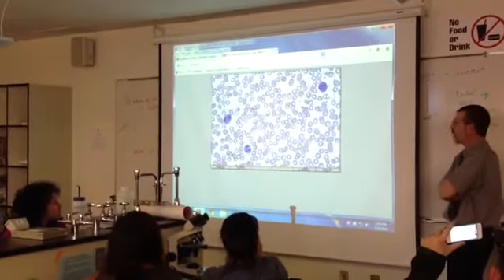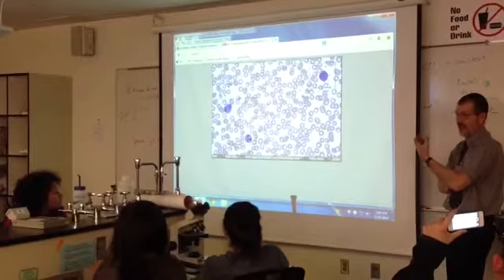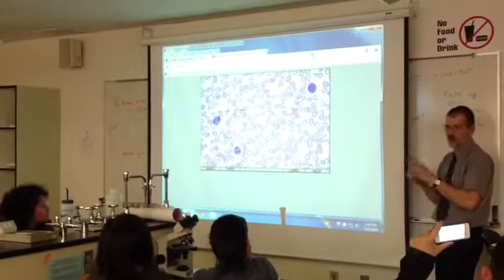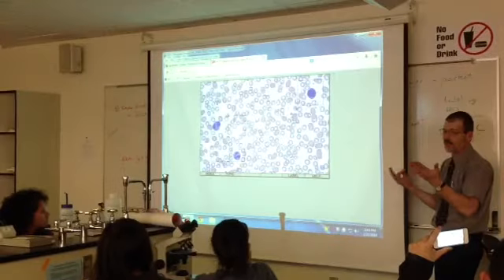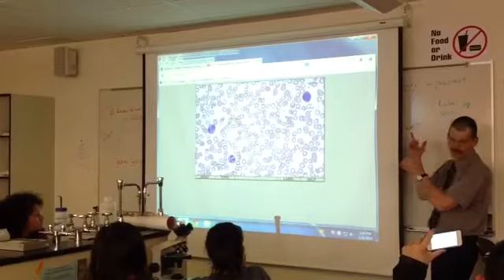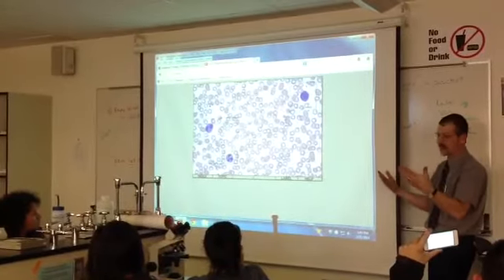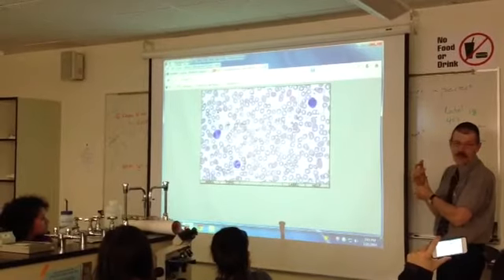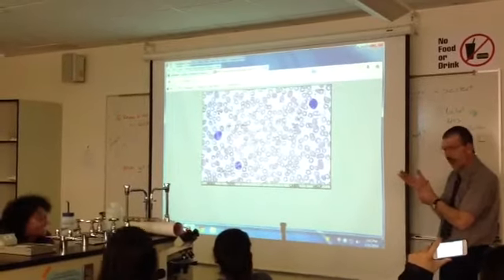So I rarely put basophils on a slide. It just takes me an hour to find one, unless I'm lucky. The chances are neutrophils, lymphocytes, monocytes, those I can find in 2 seconds. Eosinophils take me about 20 minutes. That one takes me longer, just because it's the most rare. It's unlikely I'm going to see it on a slide. Right? You should still know it. Just realize, don't keep saying basophil on your exam. Probably not the one I found.